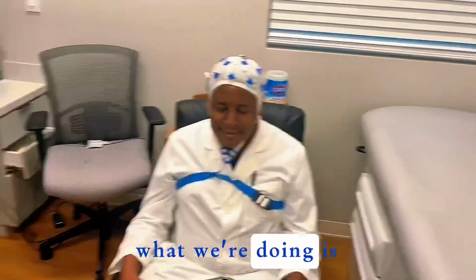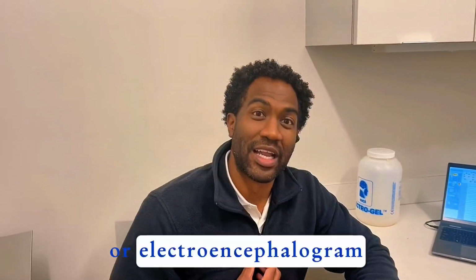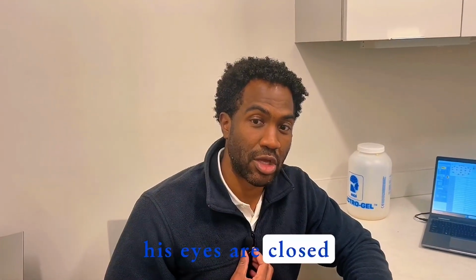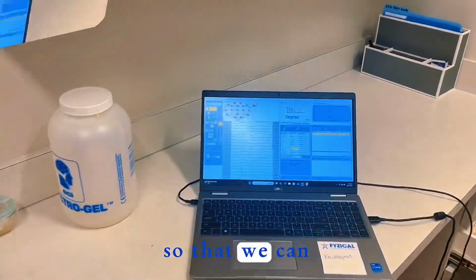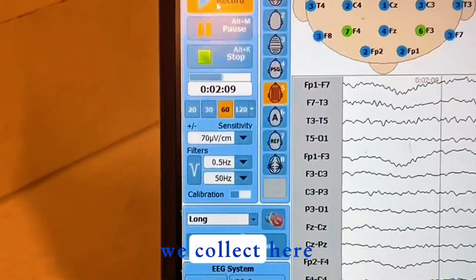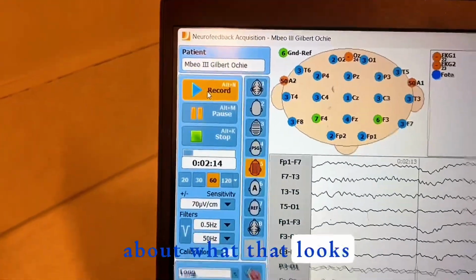Today, what we're doing is called a Quantitative EEG, or Electroencephalogram. What we're doing right now is Dr. Mbale is sitting silently, his eyes are closed. We're collecting data here on this computer so that we can deliver specific treatment regarding the data that we collect here. And he'll be able to explain a bit more here in a second about what that looks like.